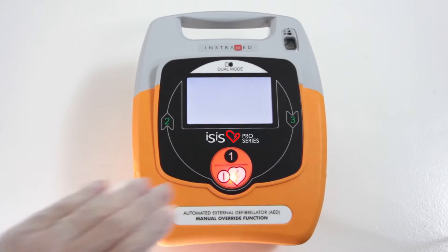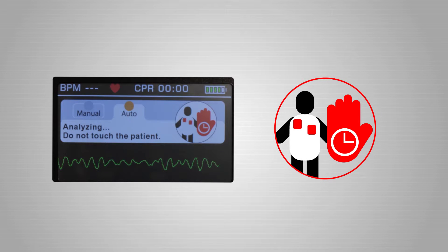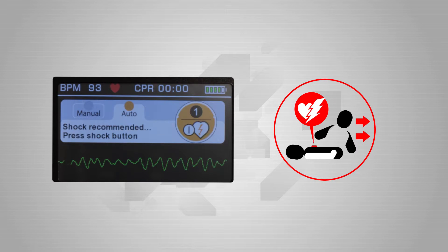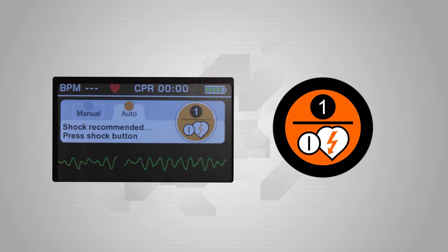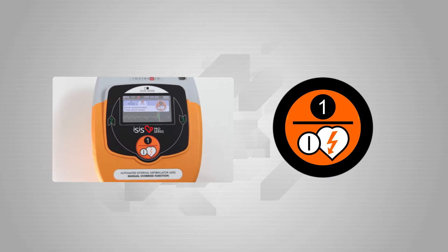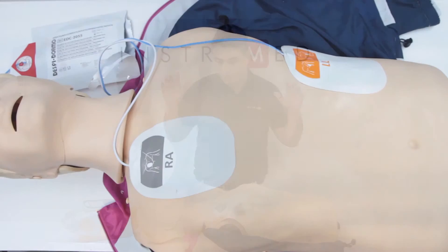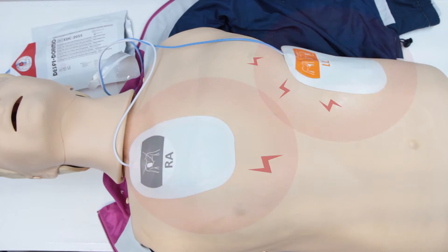Simply press the start button to use in automatic mode. The eSys will enter into its heart rate analysis mode and will initiate voice commands. Do not move or touch the patient, as this will interfere with the process of analysis. Follow the visual and audio instructions. If the need for shock is detected, the shock symbol will blink and the device will prompt the user to press the start button again. Press the start button, and be careful not to touch the patient or the conductive surfaces in contact with them, or risk receiving a powerful electrical discharge. The shock will be applied.